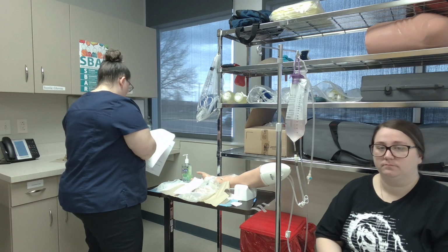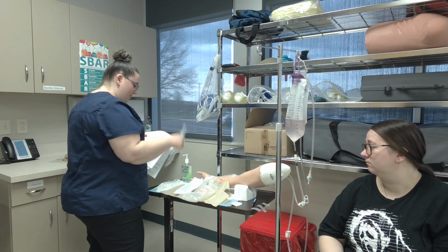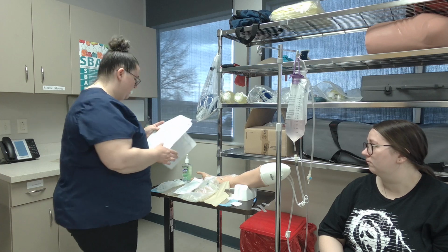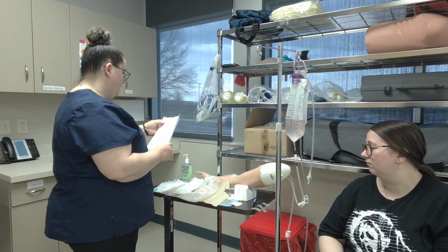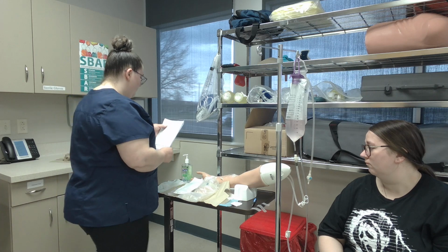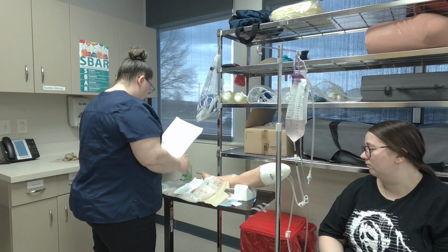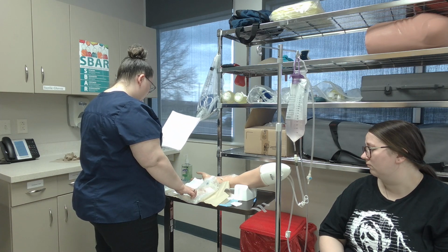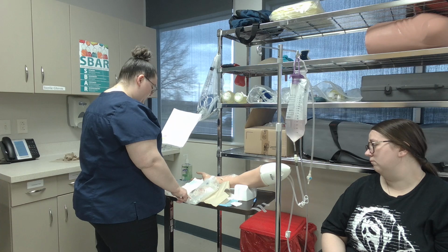I will take this out. I'll not take it all the way out. I have it open and ready. No discoloration or crystallization. For my second med check, I have Mr. Joseph Smith, date of birth 10/5/1954. 0.9% normal saline, 1,000 ml, IV continuous infusion.